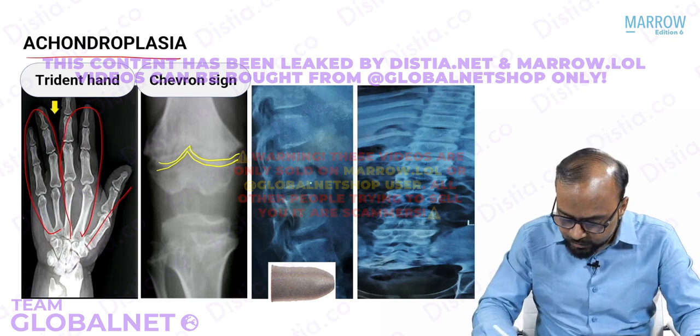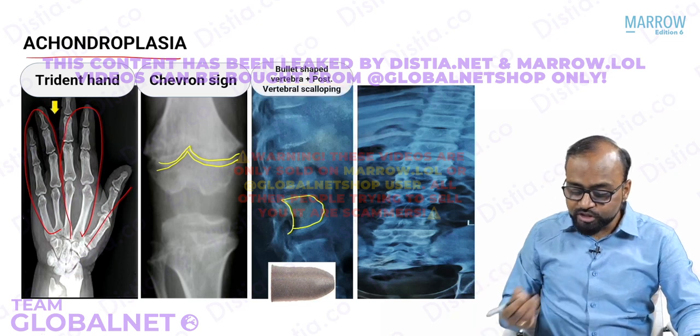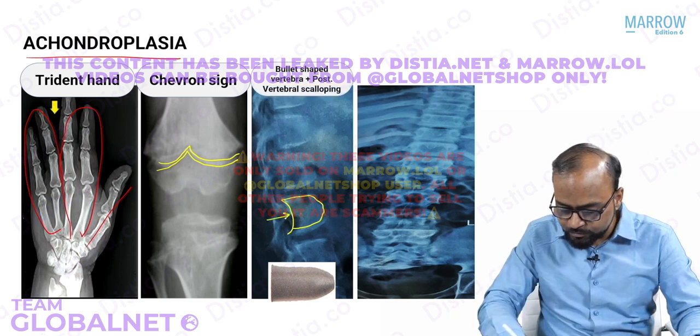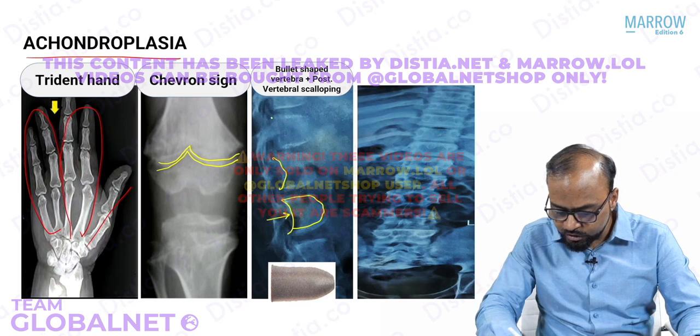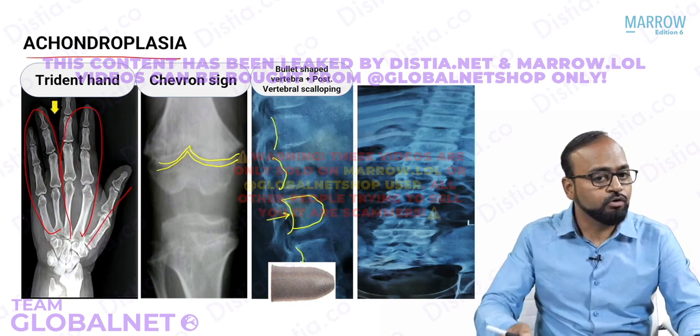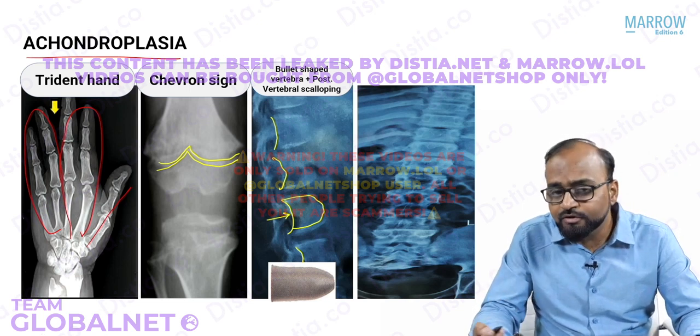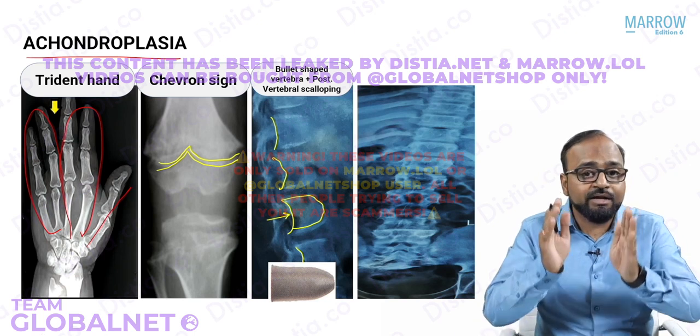Typical shape of the vertebral body: you see there is a posterior scalloping of the vertebral body and a nose-like narrowing like this. This is what is called a bullet shaped vertebra plus scalloping of the posterior margin. If you see, the posterior margins have become slightly concave. So posterior vertebral scalloping along with bullet shaped vertebra is also a feature of achondroplasia. Another feature is lumbar canal stenosis.